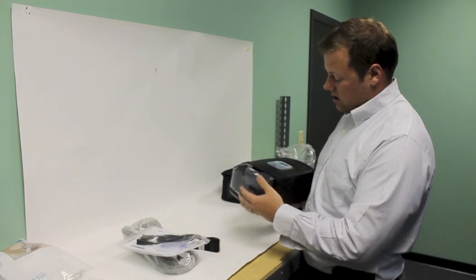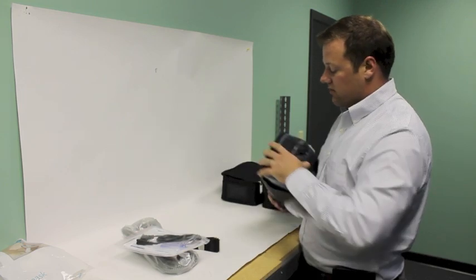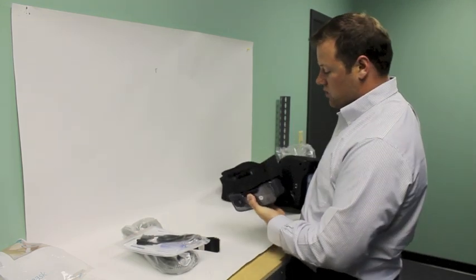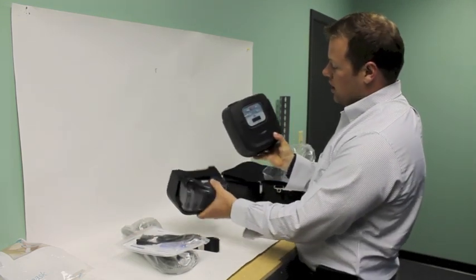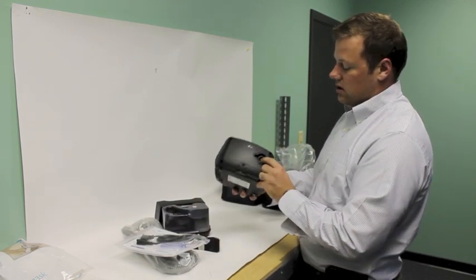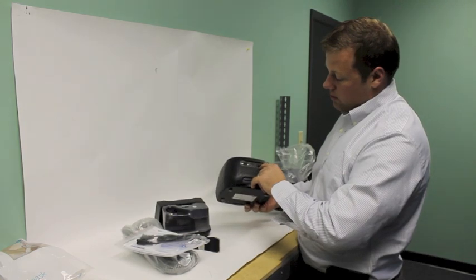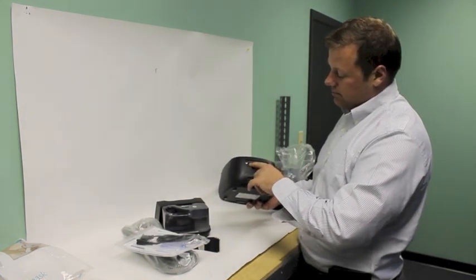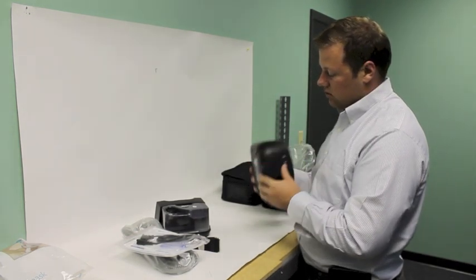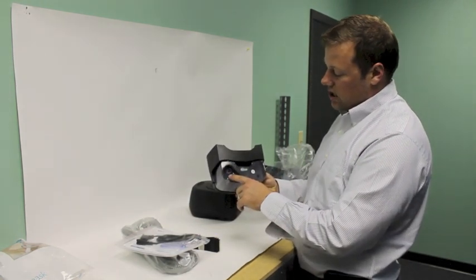So you can actually take this machine apart. You have the actual machine right here, the CPAP machine, and then this is the humidifier. You can pull it apart by pressing on this button, and then the humidifier comes right off. So if you wanted to, you could take the humidifier off and just use the CPAP machine alone. It has the 2-port right here for connection. On this back side, this is where your power would go. If you wanted to do a download, that'd be the connection. And then this is the filter right here underneath this little cover. And for the humidifier, this would be the port you'd connect your tube to.